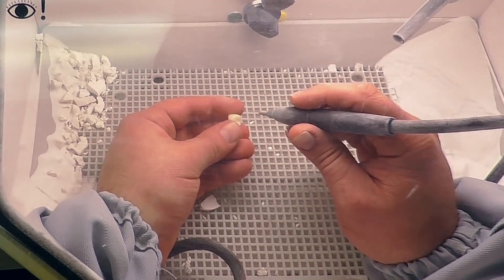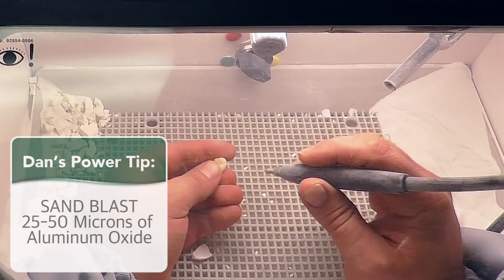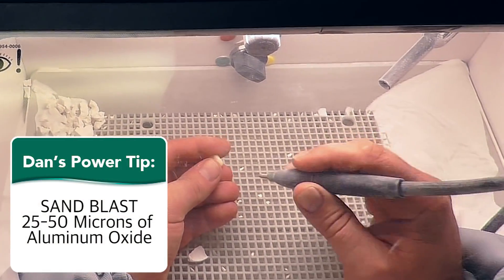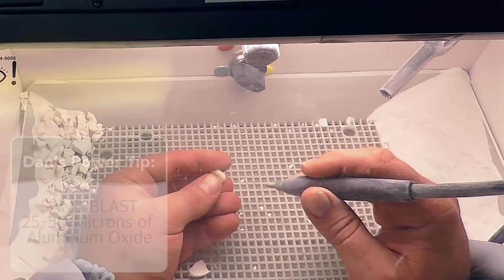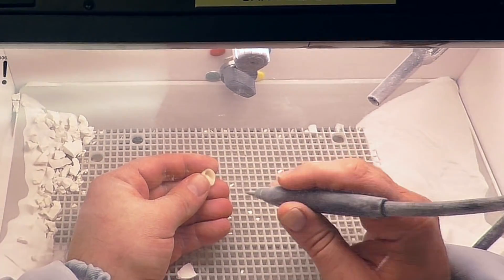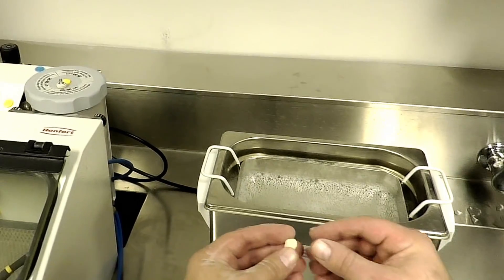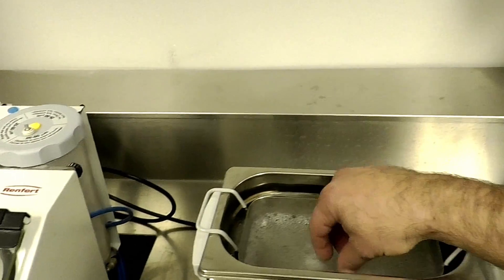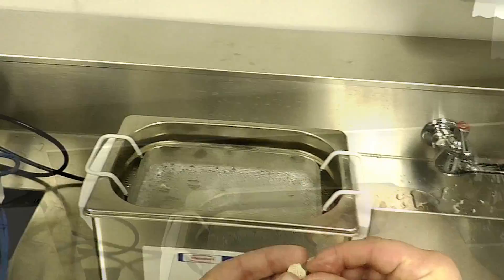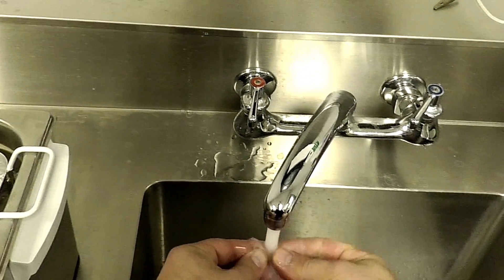Now we want to take the CERASMART restoration and lightly sandblast it with 25 to 50 microns of aluminum oxide, staying away from the margins and going over the surface and also the intaglio. After that, we put it in the ultrasonic cleaner or steam clean it to remove any residue, then take it out and rinse off any residual liquid.